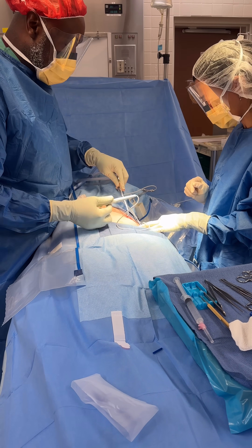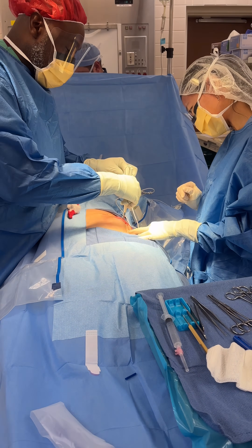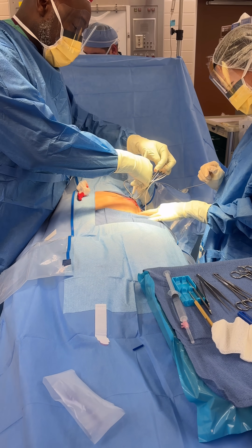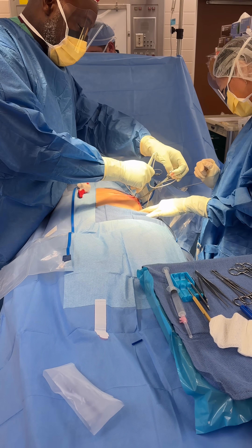See how I'm not cutting through the hole — I'm going straight down. See that? And then we'll do this side here. See how I'm not moving? I'm just kind of running and letting the electricity work, just kind of turning around.